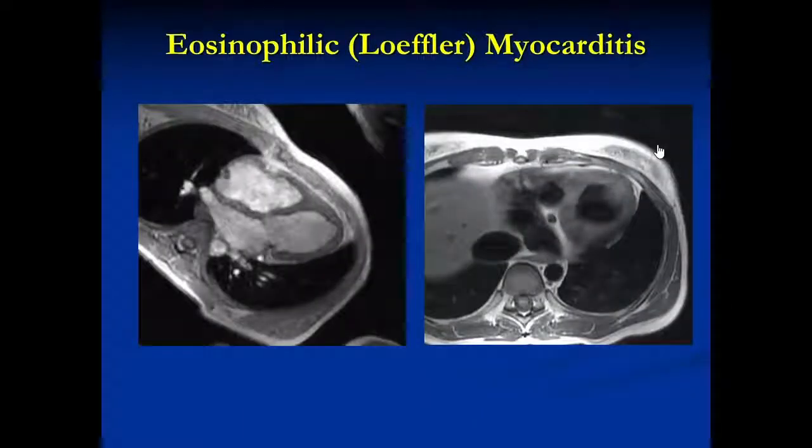And I'm basically finished. The other condition that can present with a normal heart, and you should have in mind, because it's infrequent, particularly here in the US, although in other places like Africa it's not that infrequent, is endomyocardial fibrosis. How do you get the hint? The ventricle is chopped off.